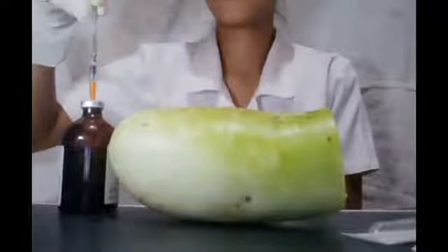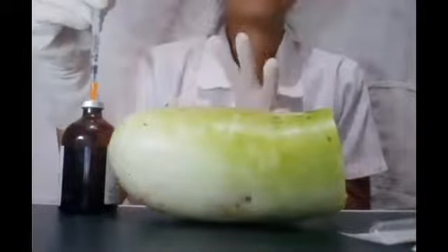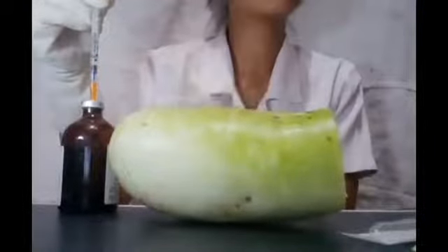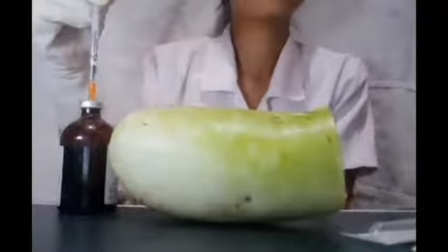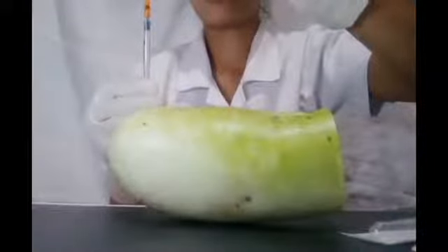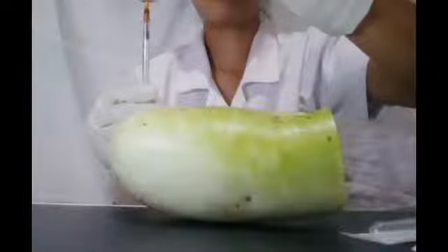We will inject. We've got to be really careful with these needles. So now we're going to invert it and pull back. So we will put 10 units out. 10 units.